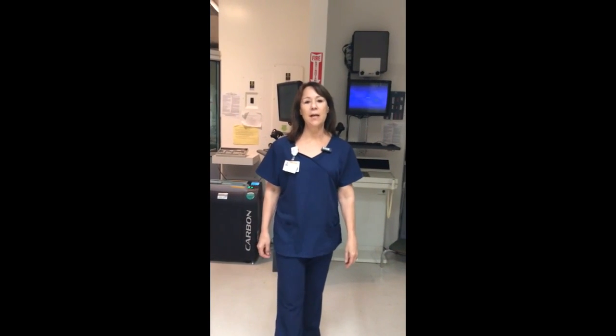Hi, my name is Lisa and I'm from RT-102 and I'm here to demonstrate 5 views of the knee. They include the AP oblique with medial rotation, the lateral view, the axial projection Camp-Coventry method for the intercondylar fossa, and the tangential projection Settegast method for the patella.